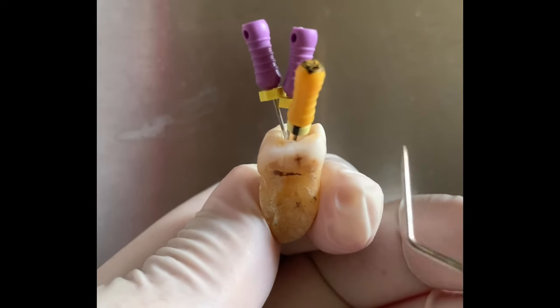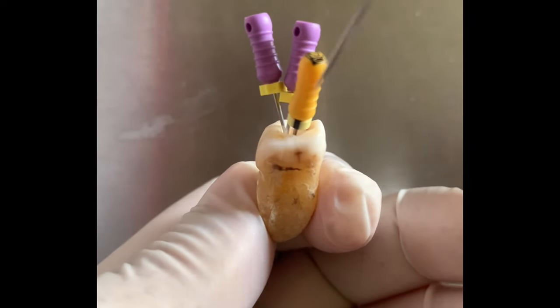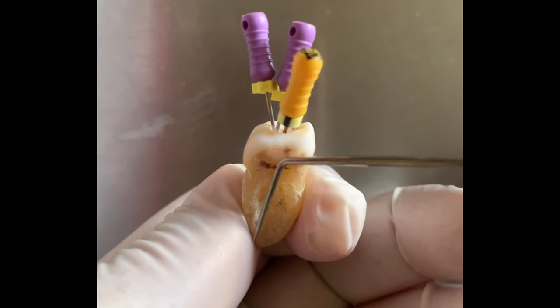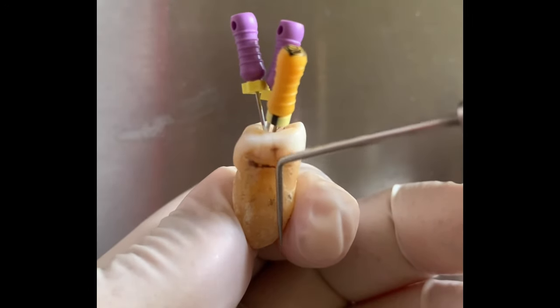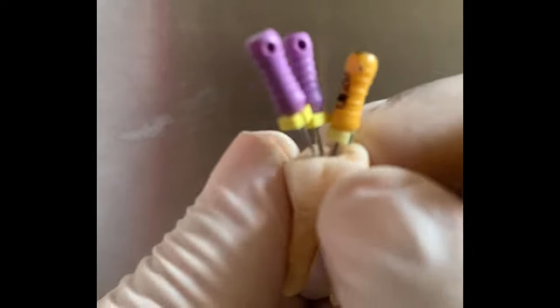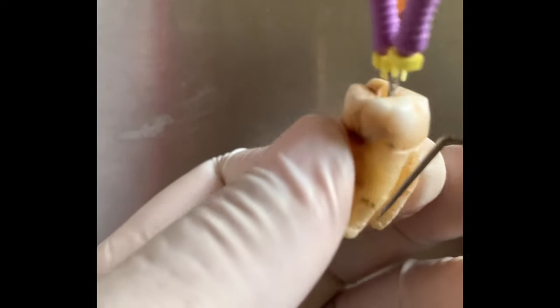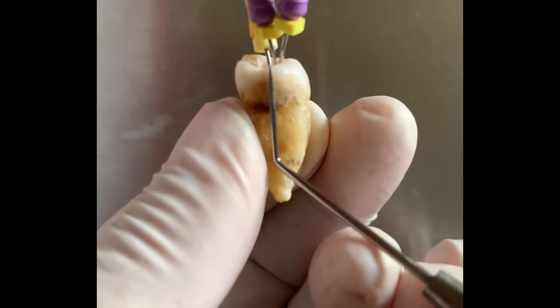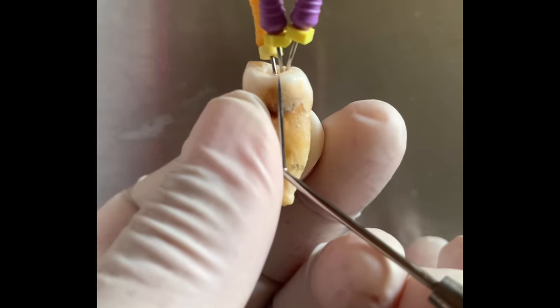This is the buccal side and this is the lingual side of the tooth. Now let us observe the path of our root canals. This is the mesiobuccal file — it moves in this direction, which is the path of the mesiobuccal root canal. This is the mesiolingual — it moves in this direction. The distal moves in this direction. Basically what you will observe is that our pulp chamber is present in the buccal half of the tooth.